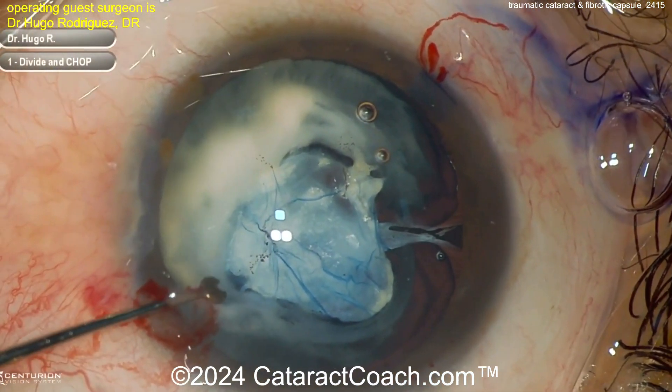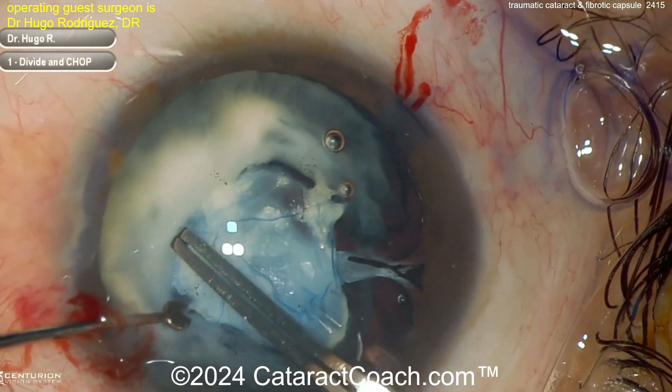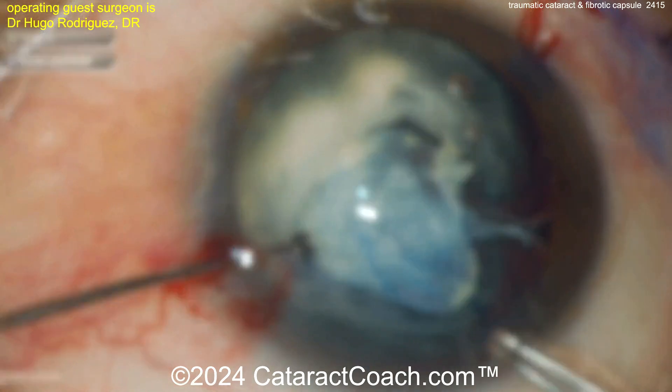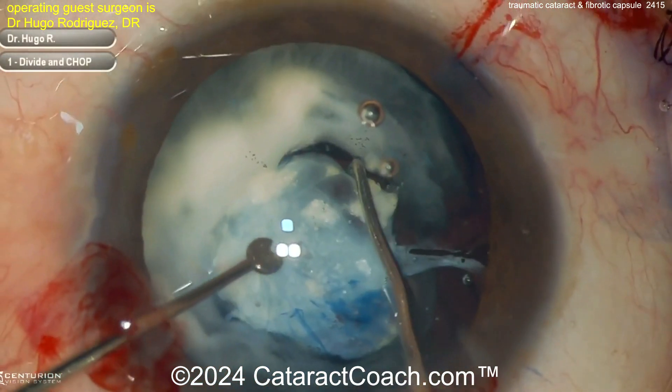Here comes the main incision — how will you even do a rhexis in this case? You can see the surgeon is grabbing in here with forceps and trying to get a rhexis done, but the capsule is so wrinkled and fibrotic it's just really not easy.